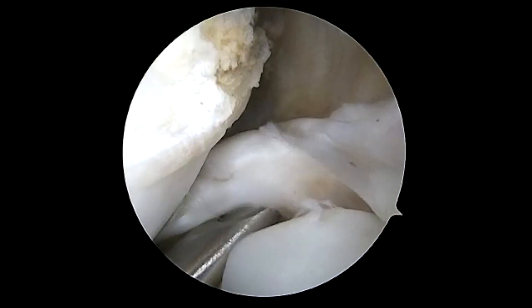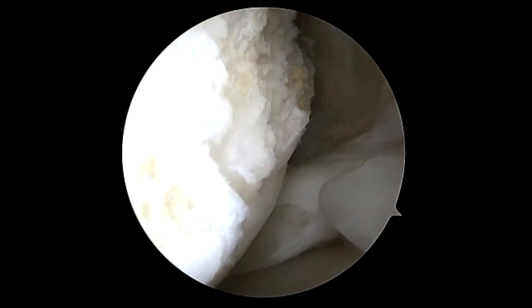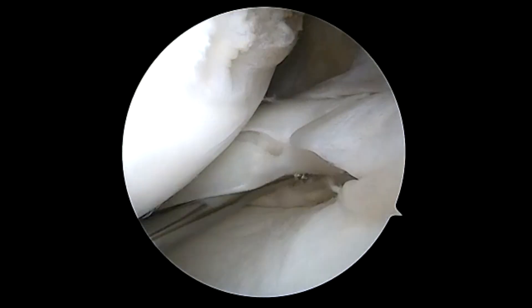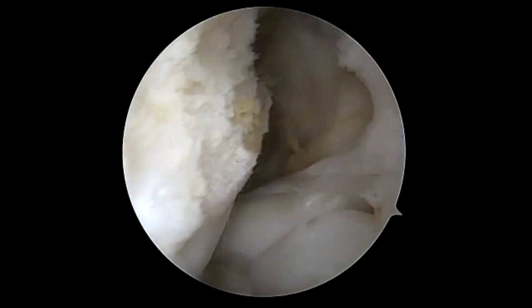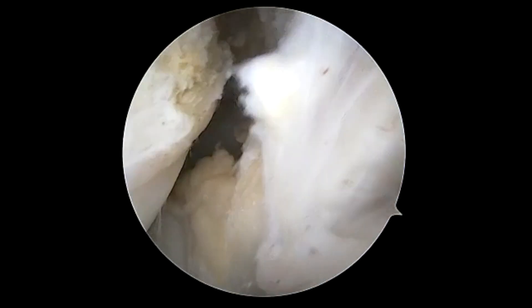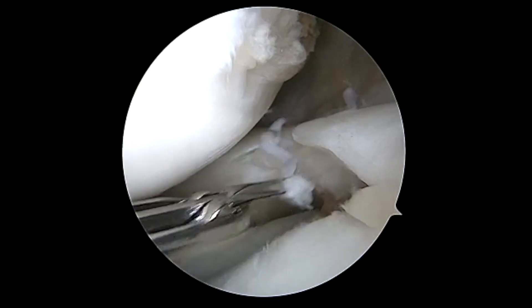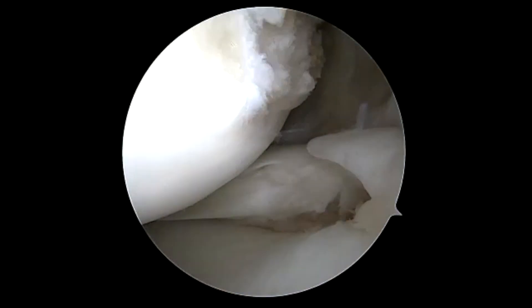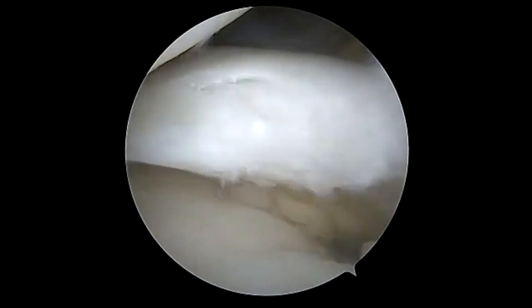You can see here the radial tear is scarred down and has not healed. We'll use a shaver followed by a ball rasp and arthroscopic scissors to clean up the two ends of the radial tear. We'll use a curette to micro fracture and allow for ingrowth at that site.